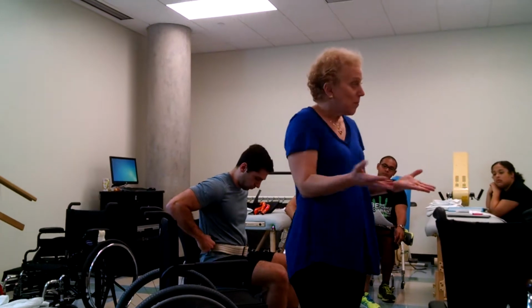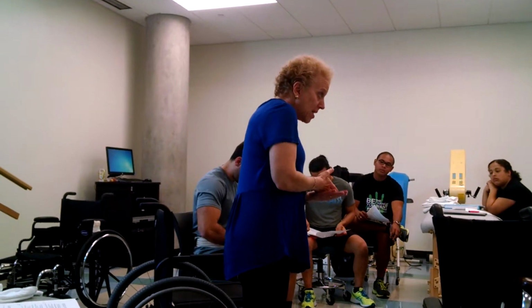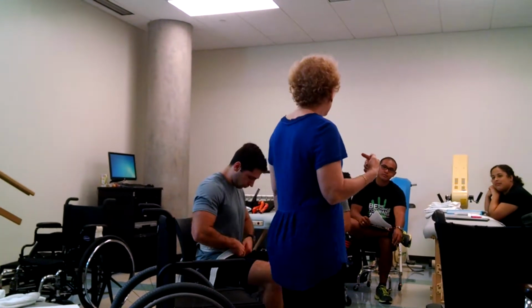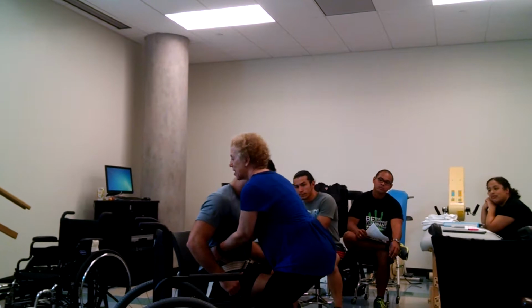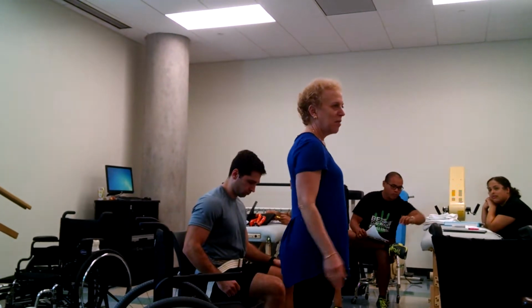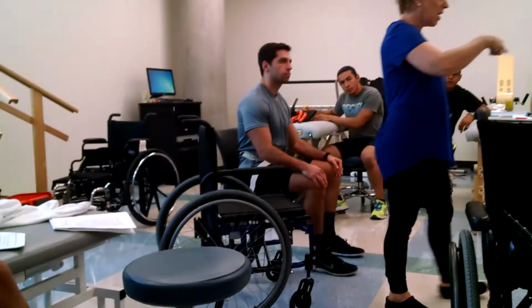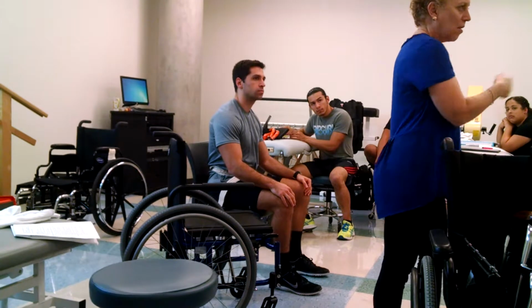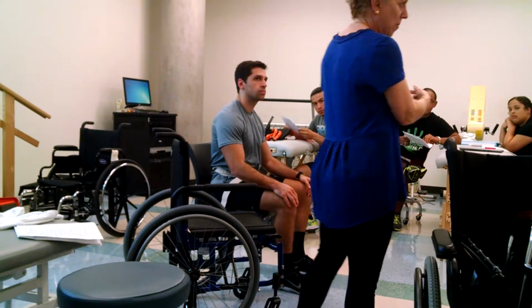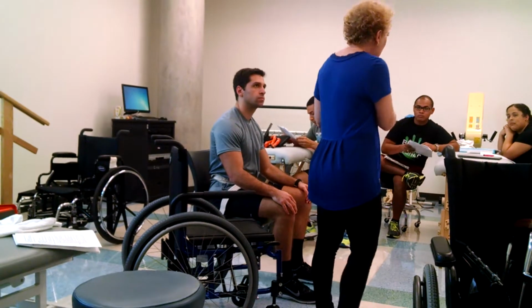So we put gait belts on our patients and we can use them. But in this class, since it's my class, we will not be heave-hoeing on the gait belt like this to move the patient. Your book talks a little bit about that. Okay? But if you do that during the practical, you'll be doing it again. Okay? Without that maneuver. Okay? So, to me, that is a no-no.